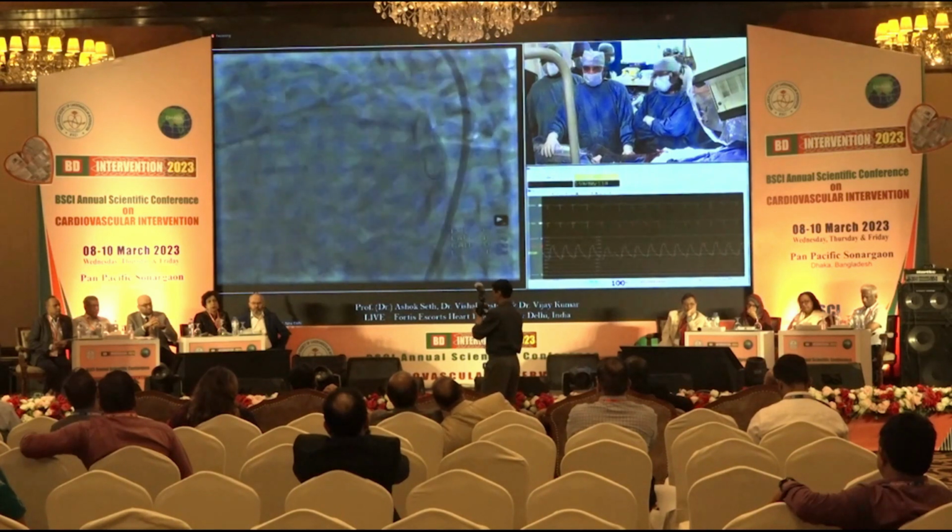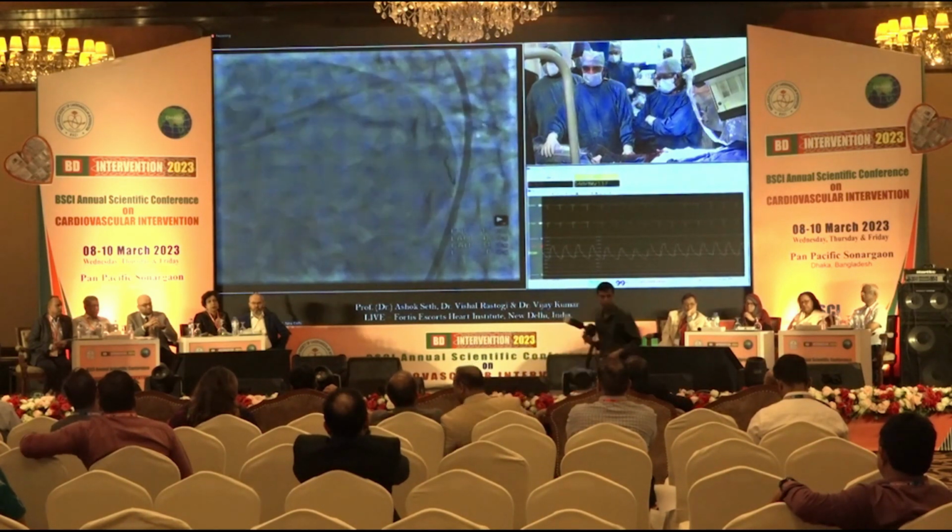Having satisfied ourselves, we went to the circumflex because we felt again that was a discrete lesion, and it provides a support when we do the LAD, and therefore we actually went to the circumflex, and that's why you see the wire in the circumflex. We went ahead and again dilated that with a 3, and then we have now implanted a 3 stent which has been post-dilated to 3.5.